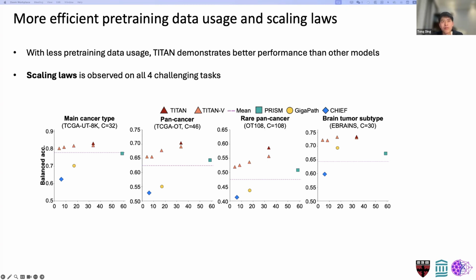And also, if you know the very early work like the HIPT model from Richard from our lab, the second and third stage vision transformers in the HIPT paper are also very small vision transformer models. It's a 3 layer vision transformer, and that works pretty well already.